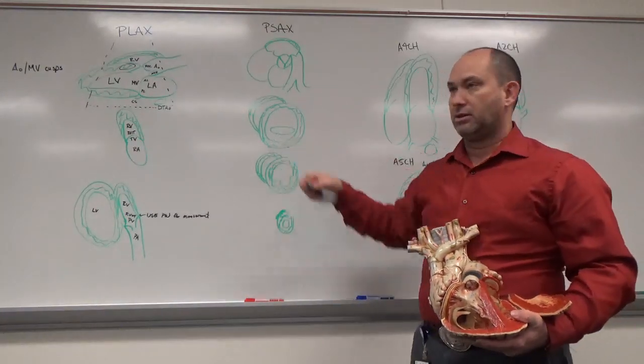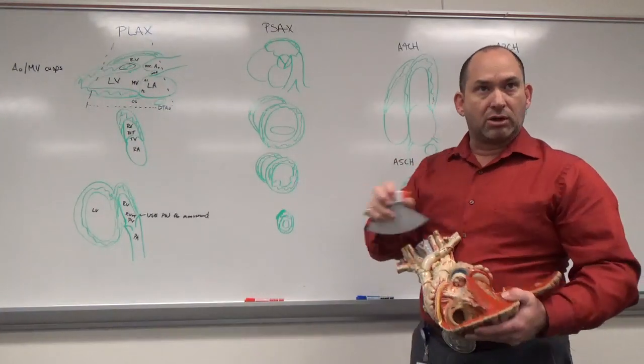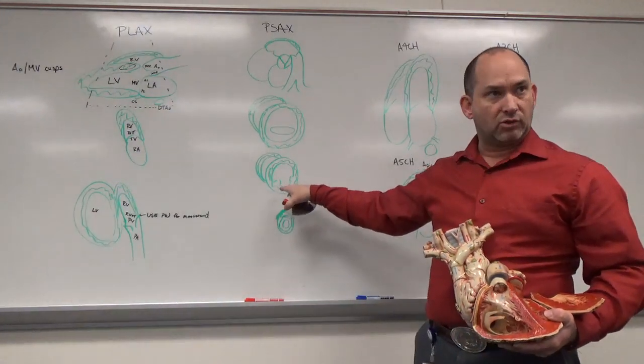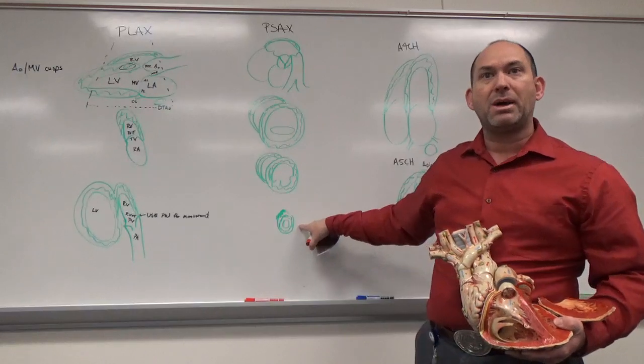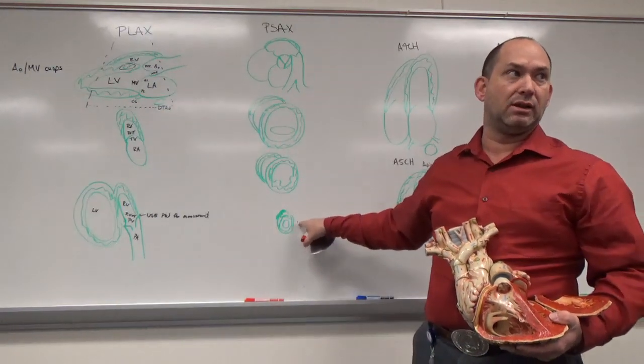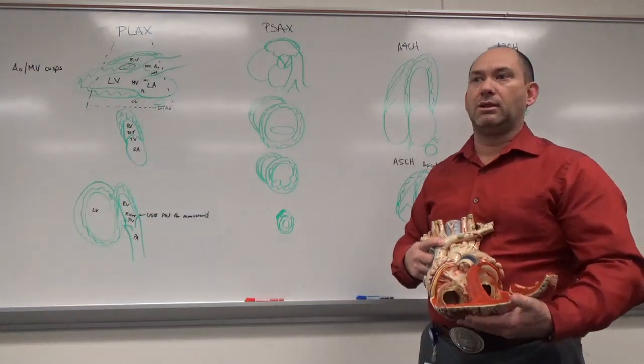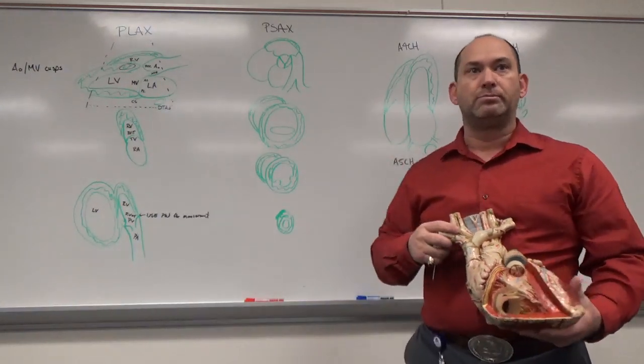Get the fish mouth on this. I need to be hitting that perpendicular to both valves, and then below that, papillary muscles need to be attached to the wall, and then beyond that, we want to get past the papillary muscles. We shouldn't see any real remnants of the papillary muscles if we're truly at the apex, and then we just see that residual little donut hole.